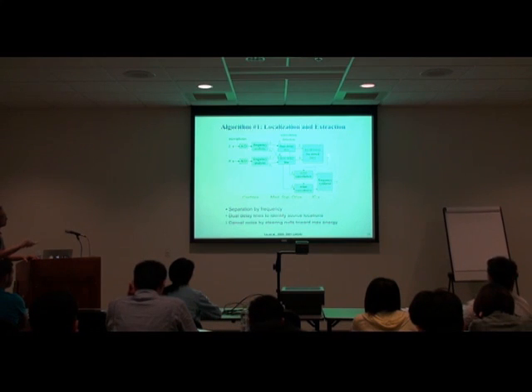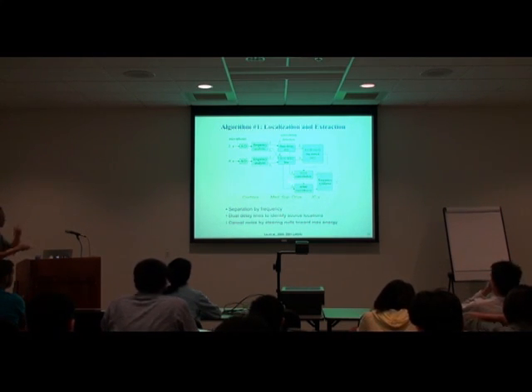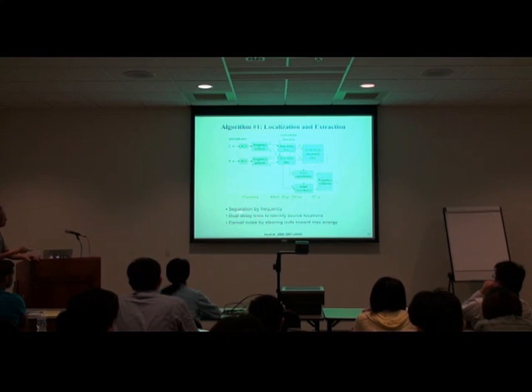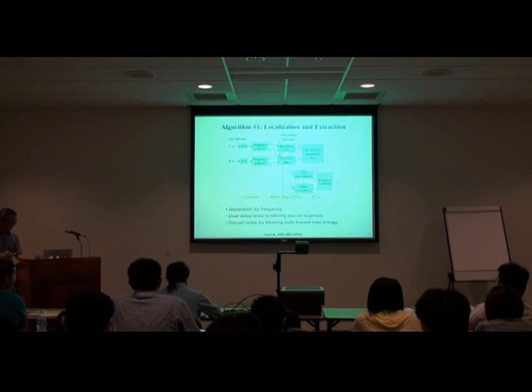Once we localize, we want to do noise cancellation of unwanted signals, and then we want to do the frequency synthesis. So the dual delay line is the crucial structure here for identifying source location and for extracting the content of the signal at that location. Now we'll talk about the scheme of localization as well as the extraction.